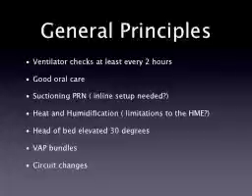So we need to get rid of that HME and transition to a proper system, a cascade system. Head of bed elevated 30 degrees. This is going to depend on a lot of factors, hemodynamic status, and so on and so forth. But if we can, we'd like to. Again, this has helped to decrease the risk of microaspiration. Even though I do have an endotracheal tube placed in the trachea and a balloon inflated, we really need to be very cognizant that I can still develop microaspiration around that tube and develop pneumonia.